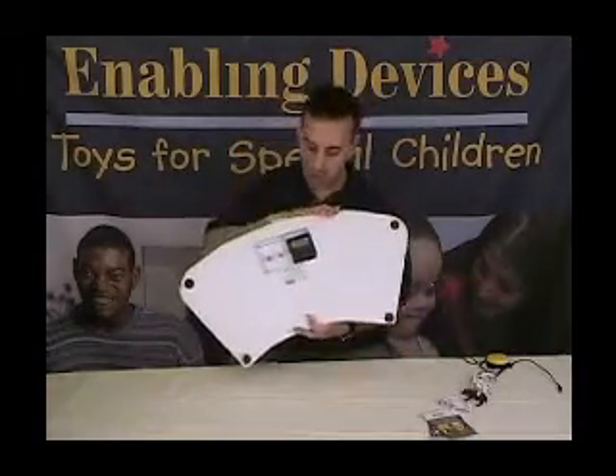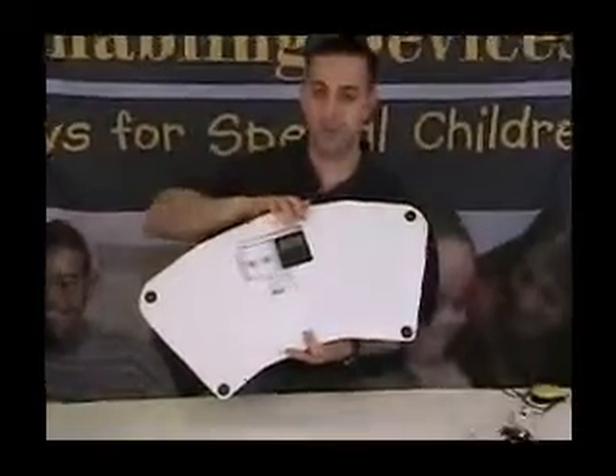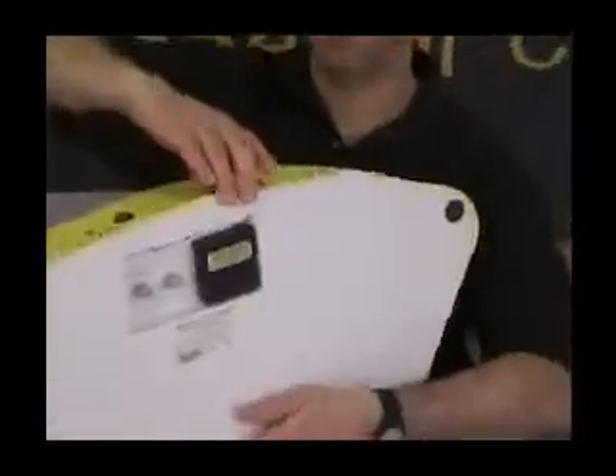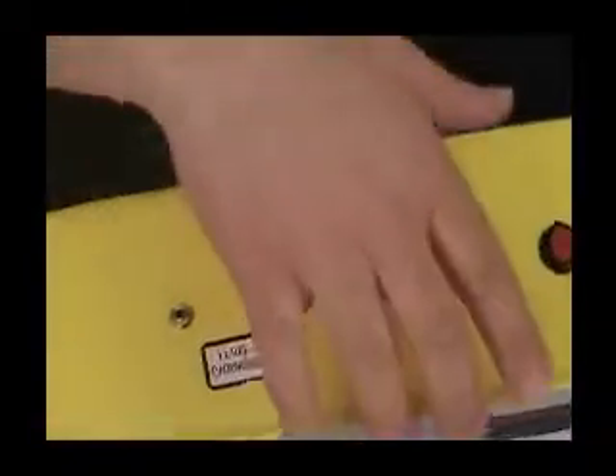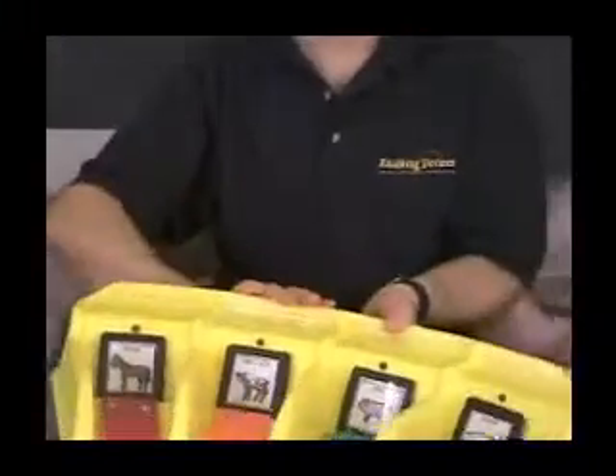On the back, you have an on/off control and also a scan speed adjustment, so you can adjust how fast the machine will scan. Also on the back, you have the level changer, record button, and then your input jack for your switch. The only way you can access or use the scanning function is through an external switch — nothing to do with direct select.